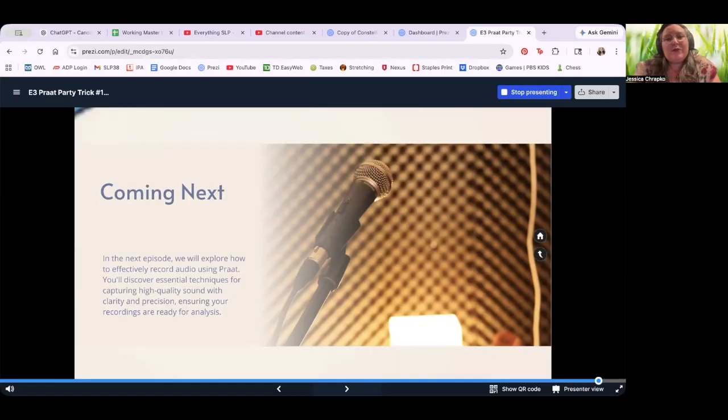Although I've done a few videos that functionally demonstrate how to record acoustic samples for voice assessments as an example, in Praat episode 4, I'll go into more academic explanation of essential techniques to capture high quality sound for accurate acoustic analysis.